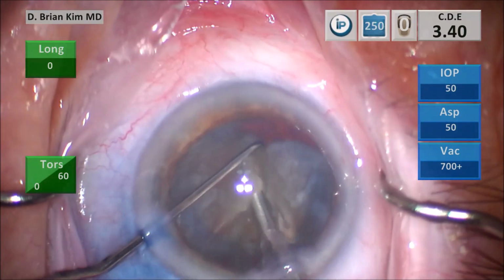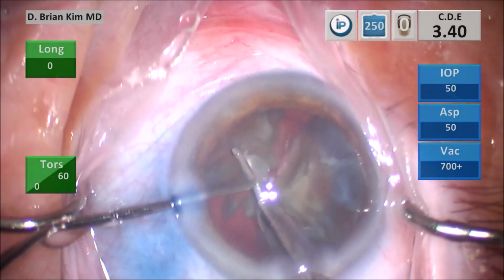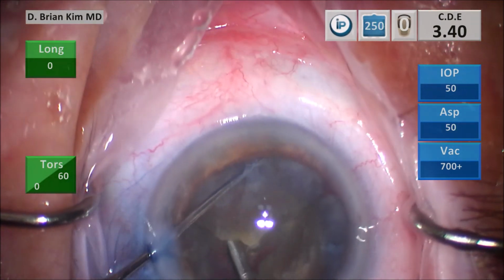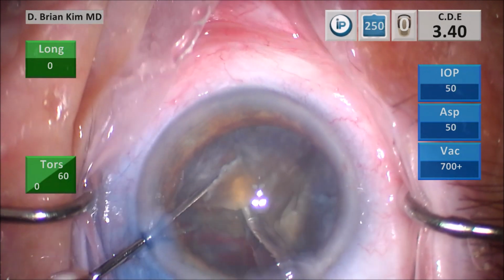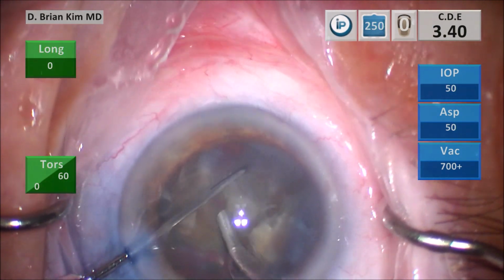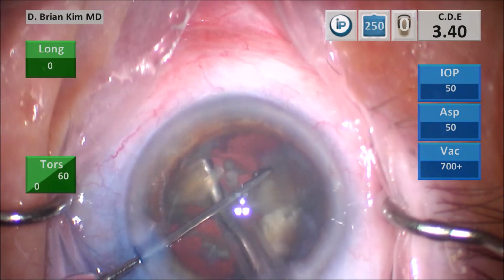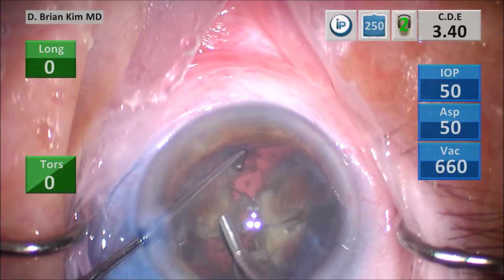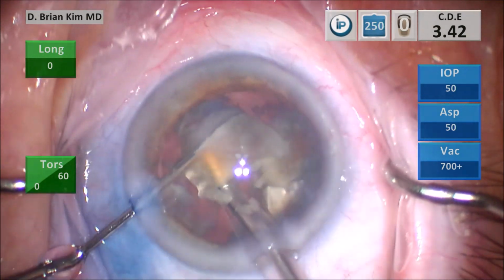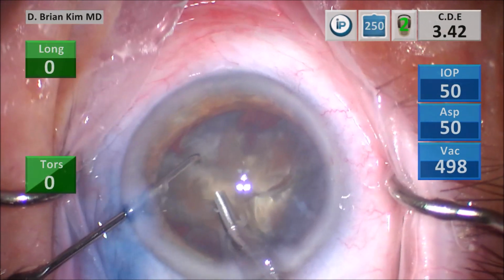So I'm getting around those two remaining quadrants in that crevice, and then I was able to separate the two pieces, getting around that third quadrant with the chopper, and then dividing the lens piece between the chopper and the phaco tip, and then cracking the pieces here. So now it's separated. Going after that very large fragment here, getting around it between the chopper and the phaco tip, crushing it and dividing it, and then kind of mashing with the chopper and the phaco tip those leathery adhesions.